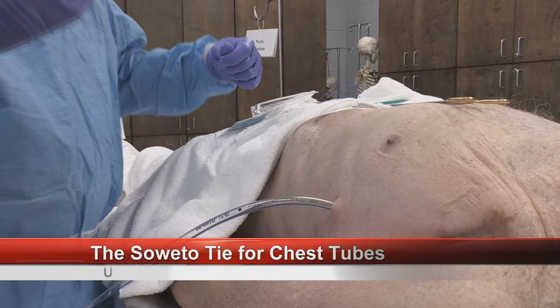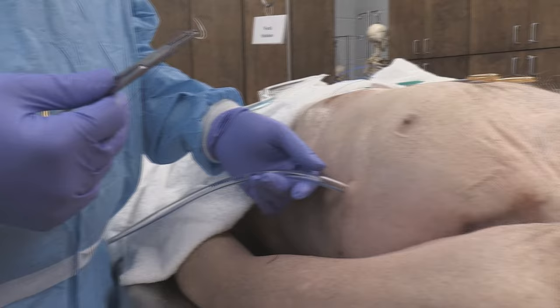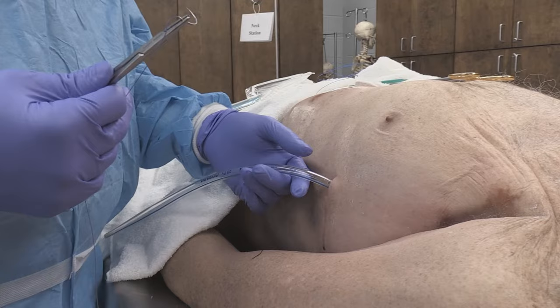Dr. Henning, what are you going to show me today? So what I'm going to show you is securing of a chest tube — multiple ways to secure a chest tube. This particular method is called a Soweto tie, which from my perspective adequately secures a chest tube very securely. So I'm going to go ahead and demonstrate that.